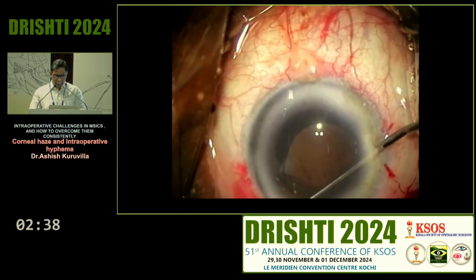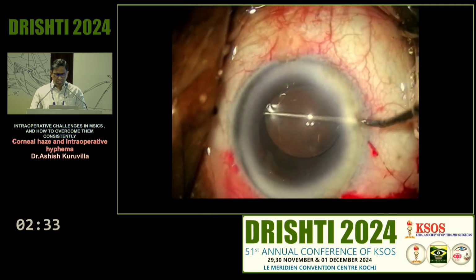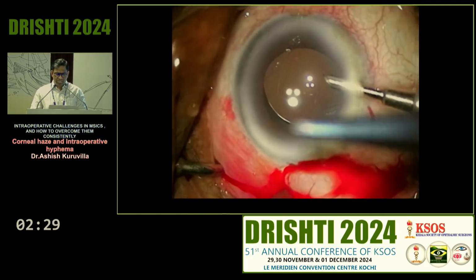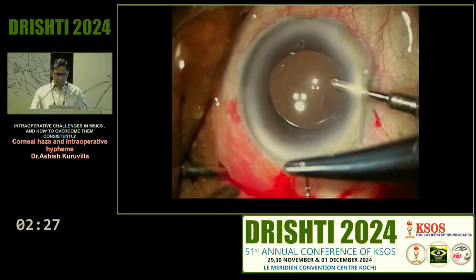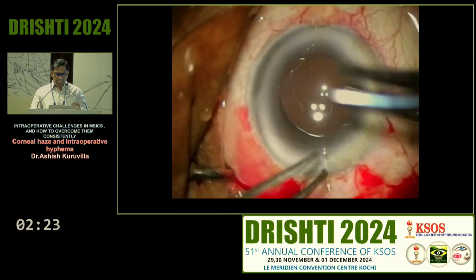So here it was actually an anterior capsular tear which had extended posteriorly. So a hydrophobic 3-piece IOL was placed into the sulcus. But the main problem was that after that there was a nice amount of leak over there. So normally this one incision would do and I'd make a suture there.